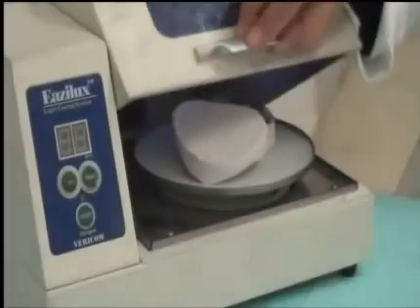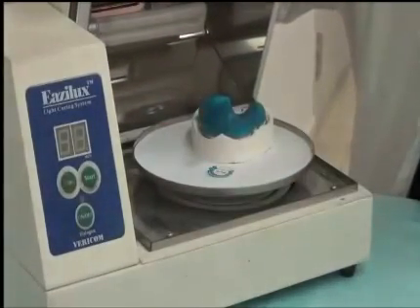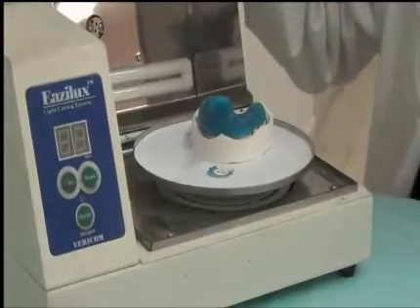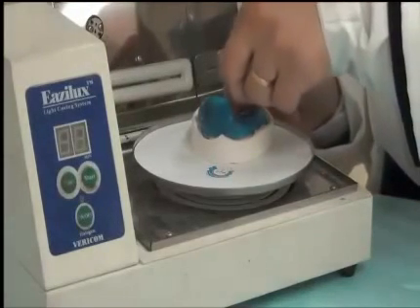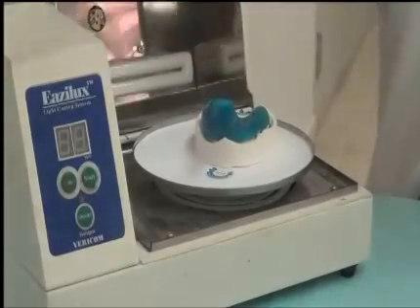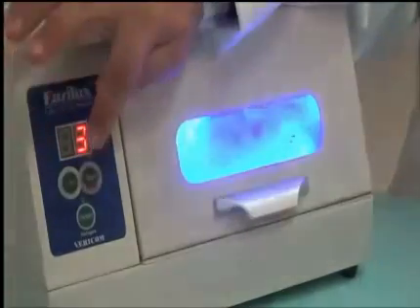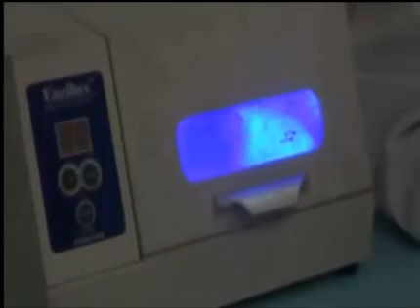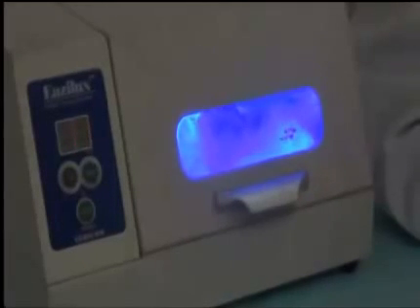At the middle of the cycle, I could open this and remove this part I was placing, because the support will be preventing the light from reaching some parts of the cast. As well, I'm removing the opaque layer that I placed on the palatal side to expose those areas now, and it could continue its cycle. We're going to wait for 3 minutes to finish, then we are going to open it, take out the tray and the cast, separate them, and put the tray alone for the fitting surface.